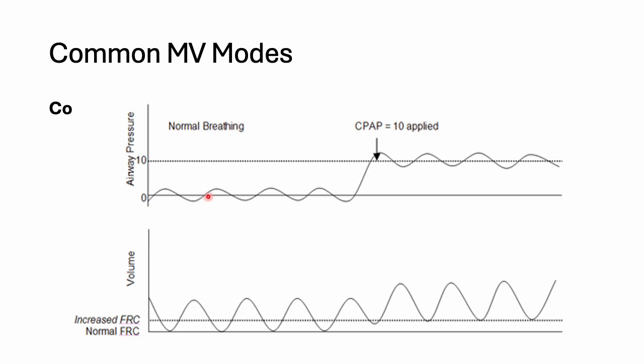Make sense? This is what we call the corresponding pressure and volume in terms of the same time continuum. So this is normal FRC.